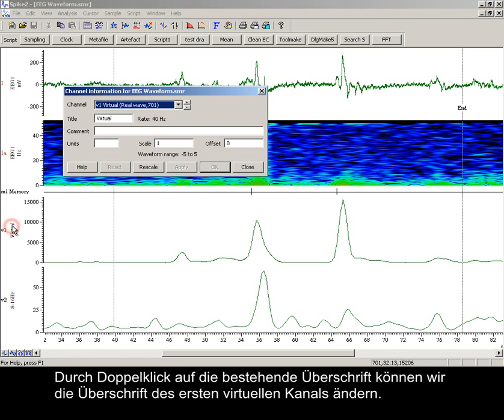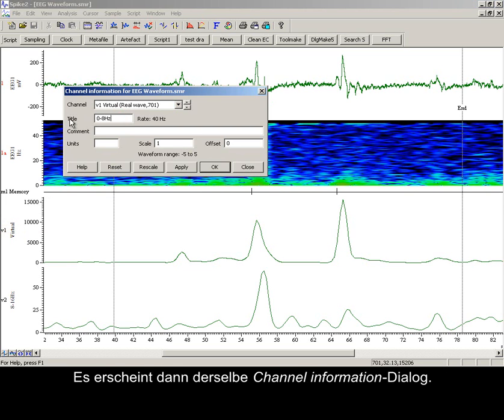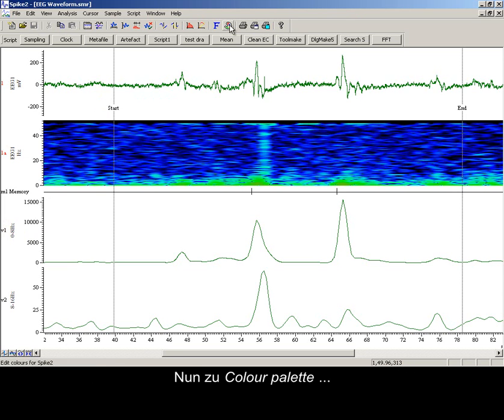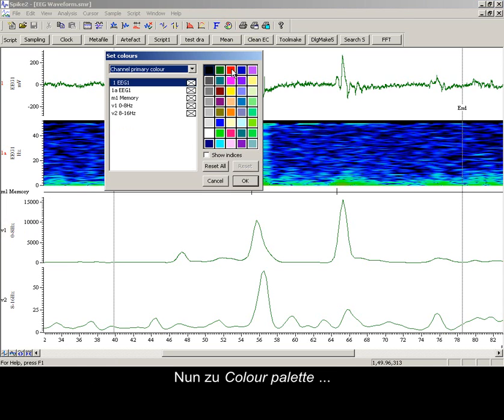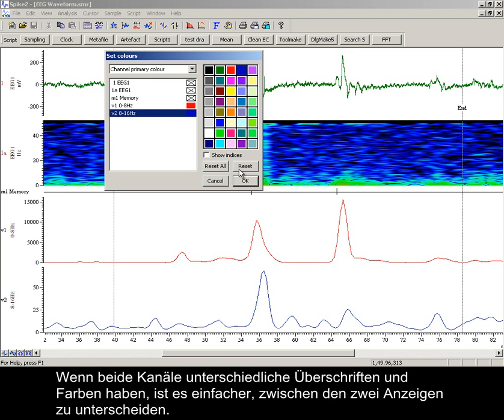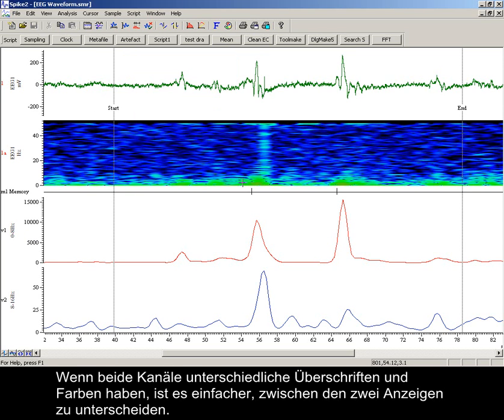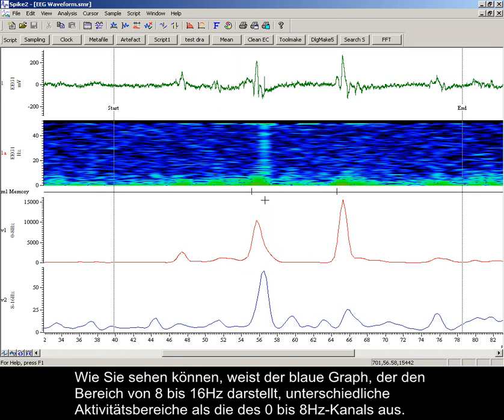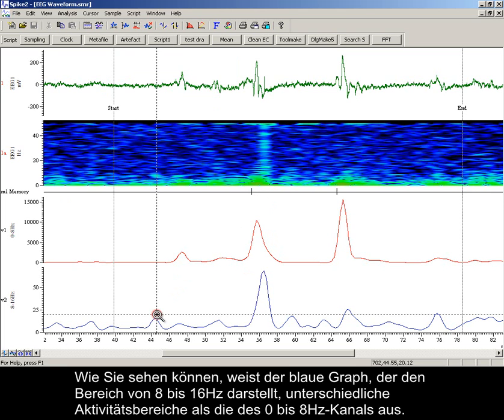To change the title of the first virtual channel, we can double click on the existing title and the same channel information dialog appears. Now to the colour palette, where it is possible to change the channel primary and secondary colours. With both channels titled and coloured differently, it is easier to distinguish between the two displays. The blue trace representing 8 to 16 Hz shows different areas of activity to that of the 0 to 8 Hz channel.